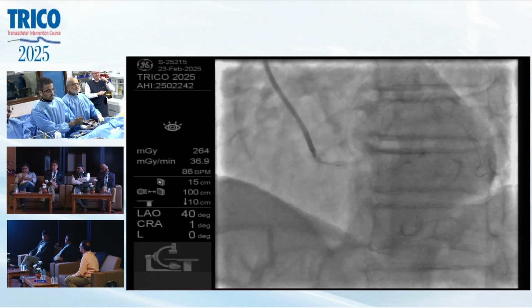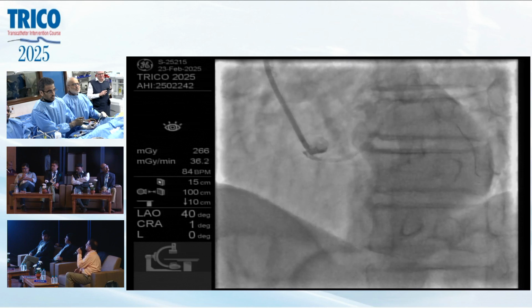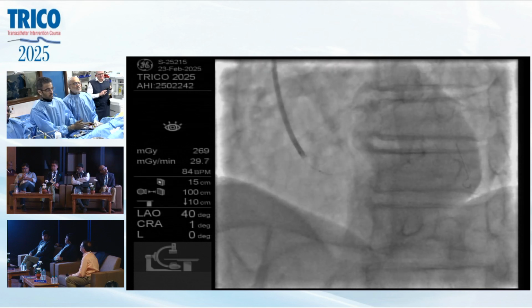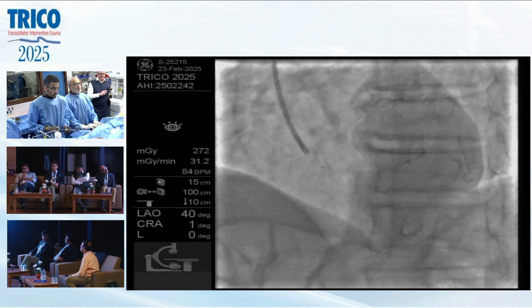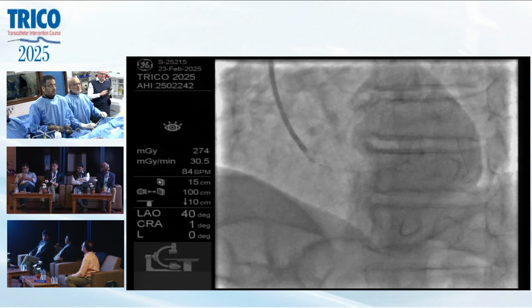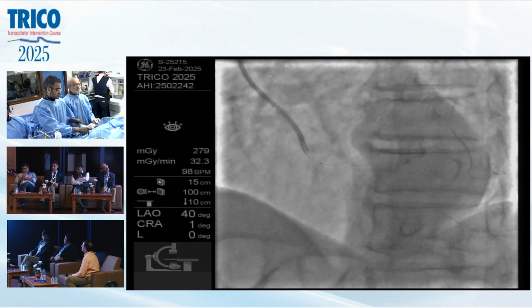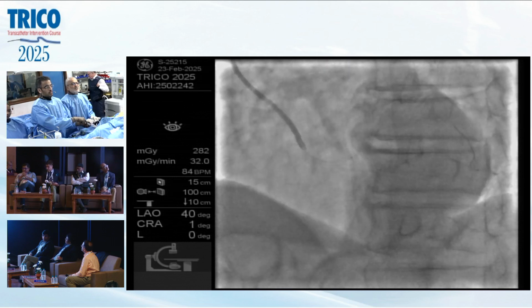Scout. This is the closest. No. Scout. Okay. Do you want to try balloon assisted here to see if it goes in? It can go here at 4. See, up to 4 atmosphere, the balloon, up to 6 atmosphere, 3, 4, the balloon remains very flexible for the guide catheter to move in. Deflate. Inject. Yeah, better. Now we will go in and dilate the lesion.